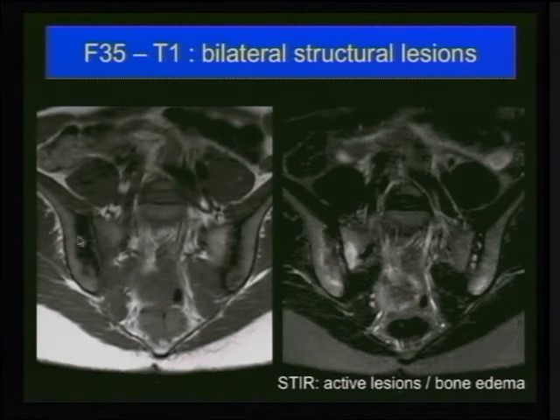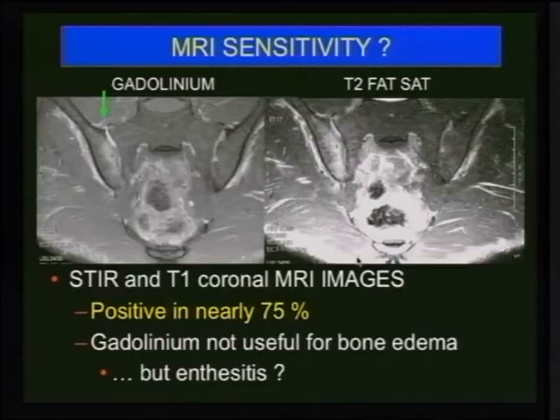If you go here, this is burned out sclerotic, more than 5 millimeters thickness, subchondral bone sclerosis. But if you go this way and you see this one, this is low signal intensity, but not the same degree as bone. So this one is low signal. It came to be bright signal. This is edema. So this is acute on top of chronic, and this is an active disease. So this is not a burnt out disease.